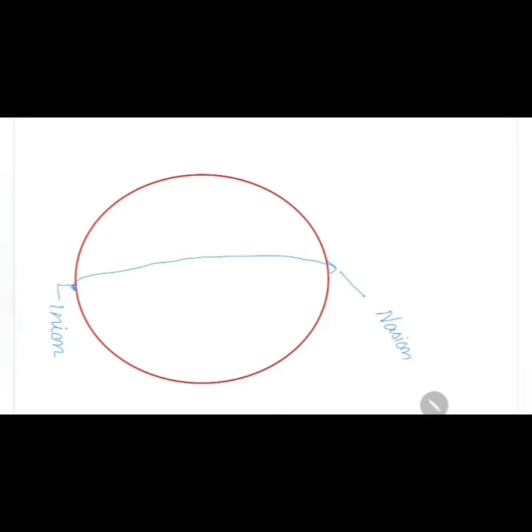line, and we will be using a tape to measure the distance between nasion and inion. Let's say I'm measuring the distance between nasion and inion, and I'm getting 10 centimeter. Okay, 10 centimeter is not possible, but let's consider it for example. Likewise, you'll have to measure from right ear to left ear. Whatever you do between nasion and inion, the same thing should be done between your right ear to left ear. So first we will measure the distance between the nasion and inion, and we will start placing the electrodes.